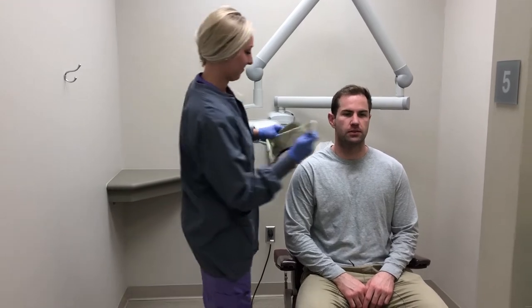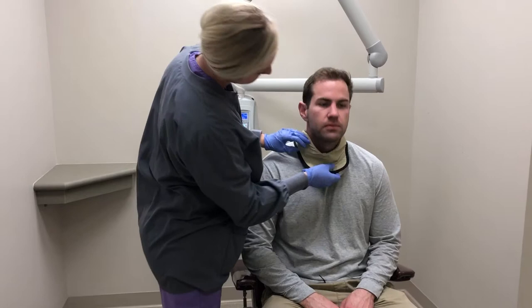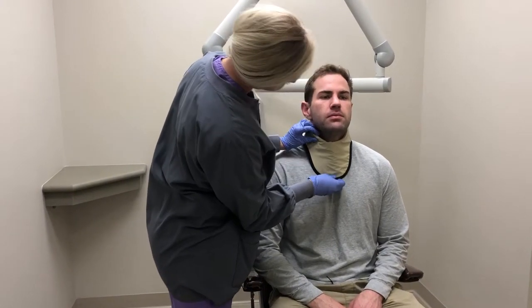Once those steps are completed, you are now ready to seat the patient. Place the lead thyroid collar around their neck and begin capturing the images.